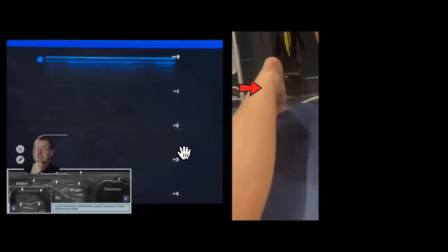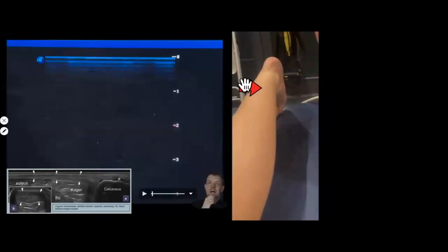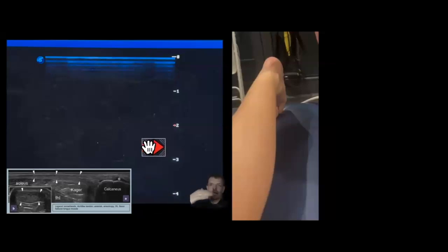Okay, so let me just move me out of the way. Here's my screen. So I've got the depth down the side there. Can you see where the red focus area is here? So I've got this quite deep. And on this video, I adjust the depth. I just want to show you the difference between the kind of things you see if you've got it on too deep a setting compared to a shallower setting.